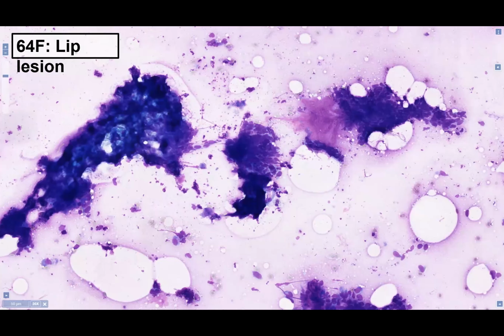Similarly, this is a lip lesion in a 64-year-old female. This was originally diagnosed as a basal cell neoplasm. This was actually a basal cell carcinoma of the lip. So just to remind you that the cutaneous lesions, basal cell carcinoma, basaloid squamous cell carcinoma, and Merkel cell carcinoma, which can frequently occur on the face and the head and neck, can be seen to metastasize to the salivary glands due to the rich lymphatic drainage.